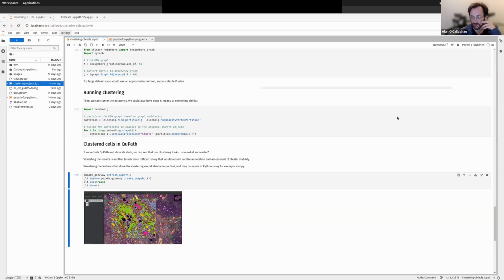We're considering options for how we might be able to support more objects in future, whether that's using a different type of plot or implementing some smarter subsampling strategies, where maybe you're not plotting all of the cells in very dense regions, but more plotting all the outliers and then subsampling points in the middle, or using a more efficient plotting technique or library that should be able to handle more objects.